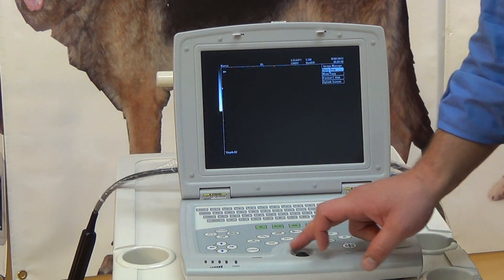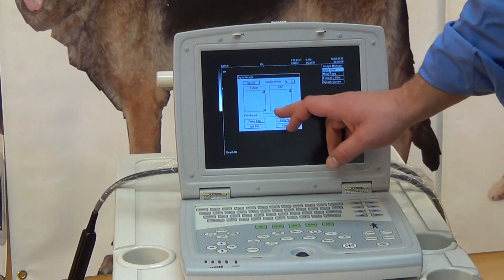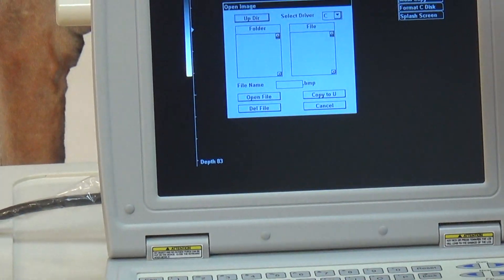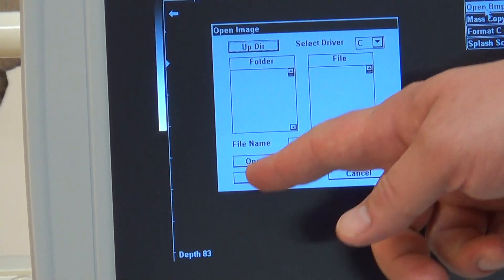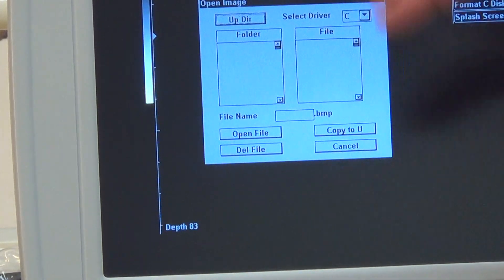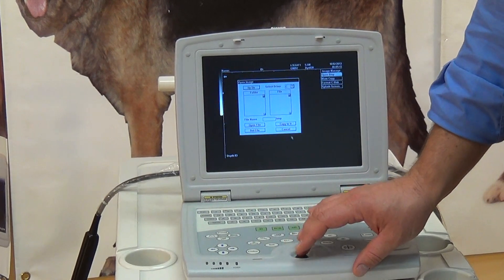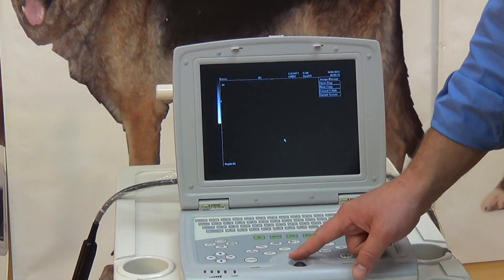If you open it, that's the top button here, you can select from your C drive, which is the computer, to like an A drive, which is a USB, and save, delete, or copy from the computer to the USB and vice versa. So it's pretty self-explanatory. It's not that challenging to get that going.